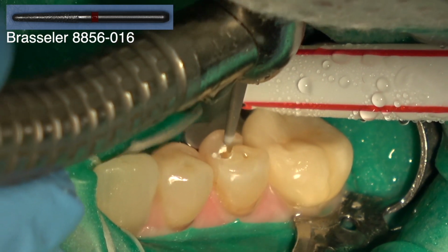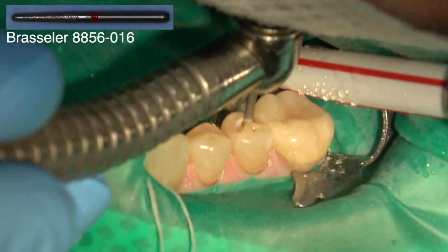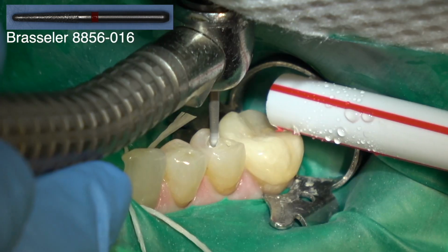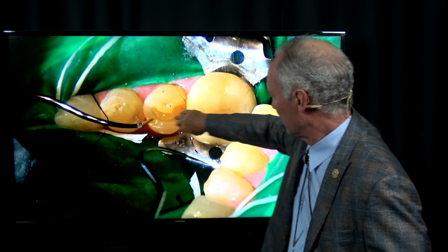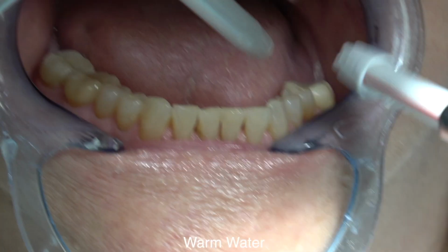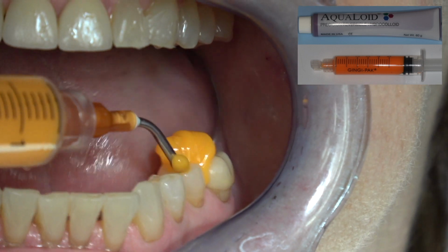Then I'm coming back with a fine, small barrel diamond. You want this mesial part to be widened just a little bit so it locks it in. See, this is widened just a bit. So all of these walls must draw, because that inlay is going to seat into the preparation. It doesn't need to be subgingival. This is reversible hydrocolloid, which is a deadly accurate impression material.